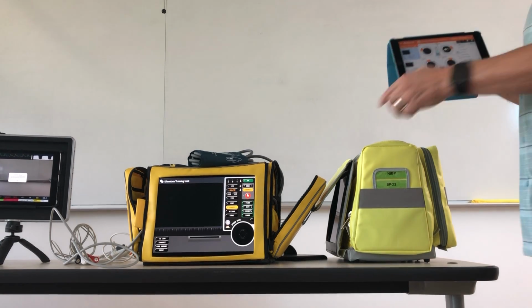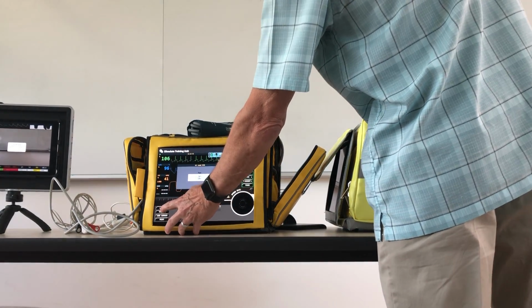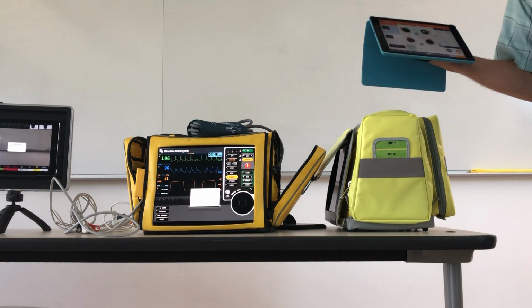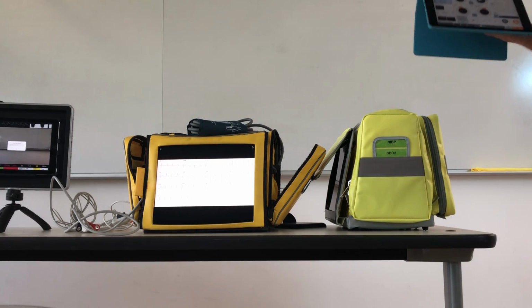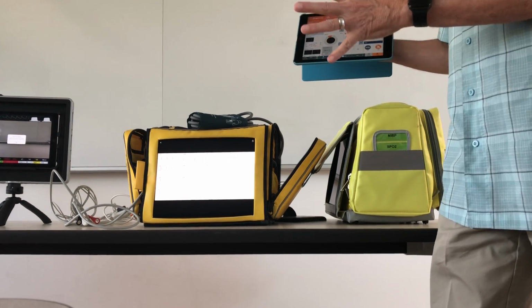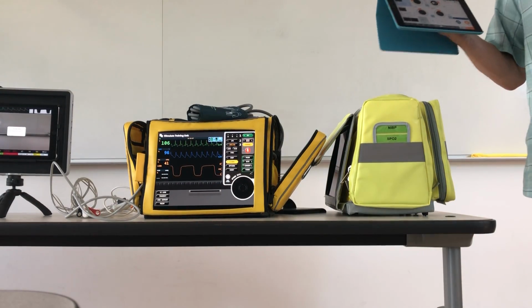This one people liked, because if you're using a LifePak, when you do the 12 lead on the LifePak, just like it does on a LifePak, you've got to dial up the age of your patient first, male or female, and then when you acquire it, it prints it out for you. Which is kind of funny. How do you rip that off? And then it pops up. That's the challenge. Ripping the iPad off is kind of hard. But it does pop it up in a full screen view so they can look at it, decide what it is, and then you just exit out when you're ready to go back to your screen. So that's kind of nice.